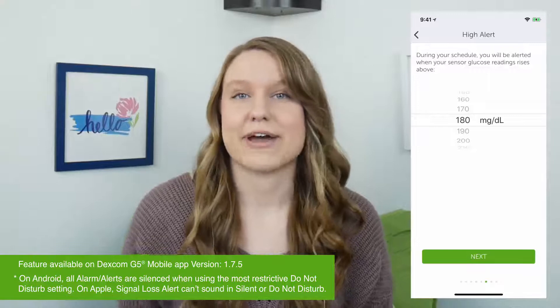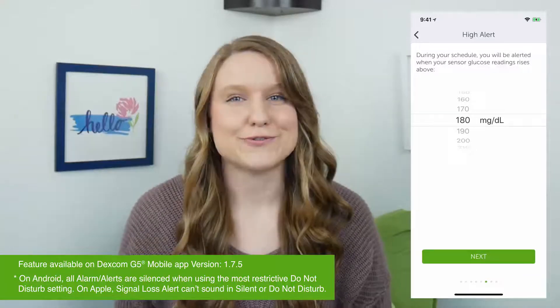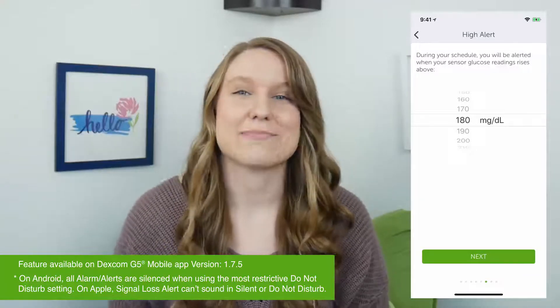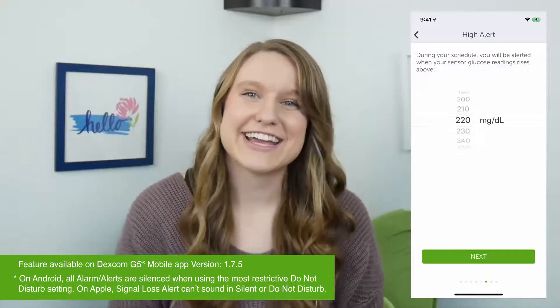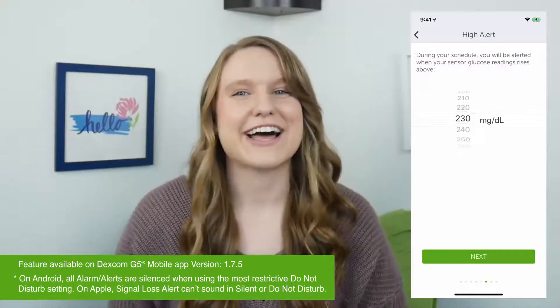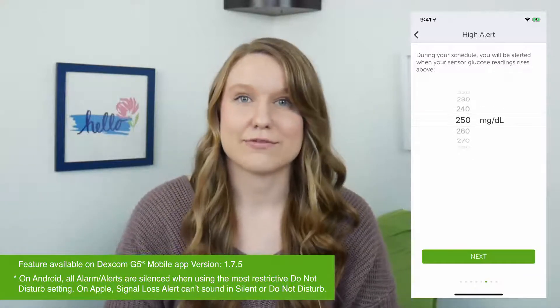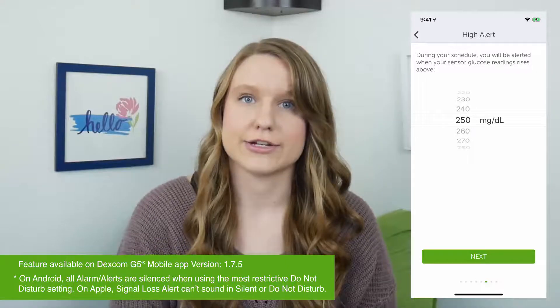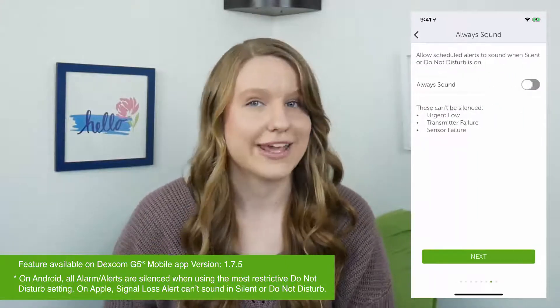I set my high alert to 250, because I like my high alert at night to be a little higher than my regular high alert that I keep at 180.